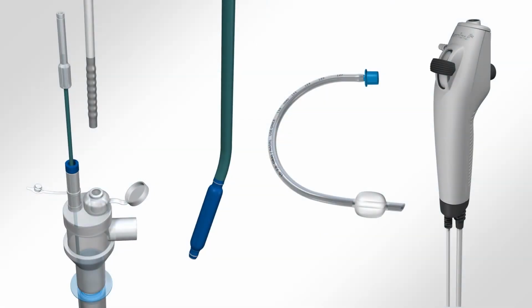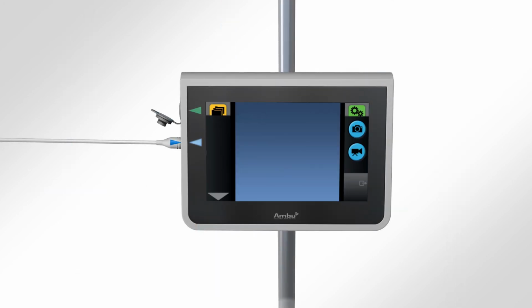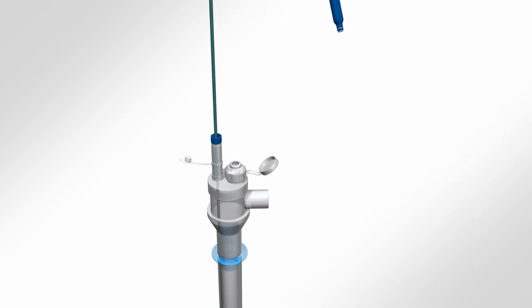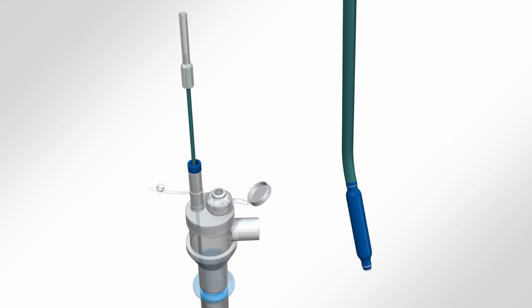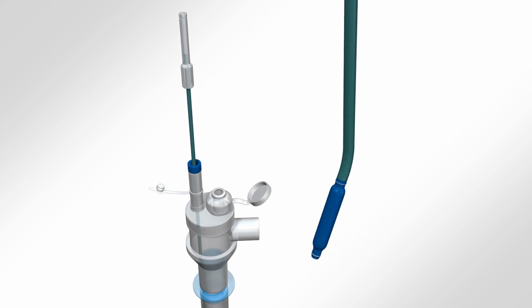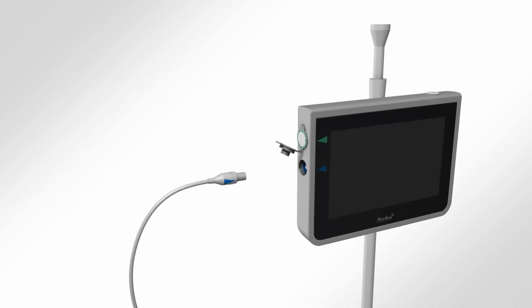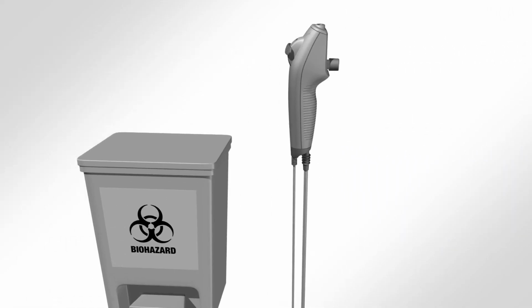To use the aScope to assist in bronchial blocker placement, connect the aScope 4 Slim to the monitor, again aligning the blue arrows. Attach the multi-port adapter of the bronchial blocker to the indwelling ETT and insert the aScope 4 Slim into the bronchoscopy port. Use the aScope to visualize placement of the blocker in the desired bronchus. Inflate the bronchial blocker balloon, confirming proper position with the aScope. Remove the aScope. Once removed, disconnect the aScope from the aView.